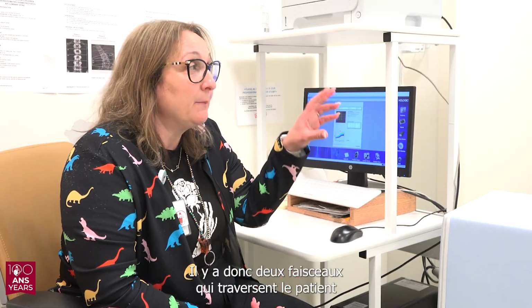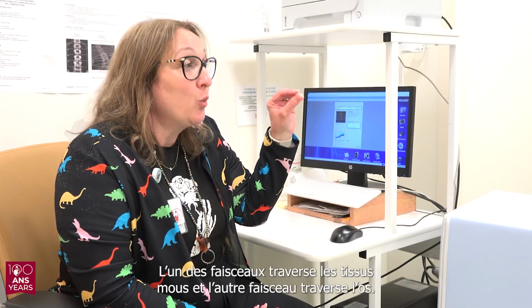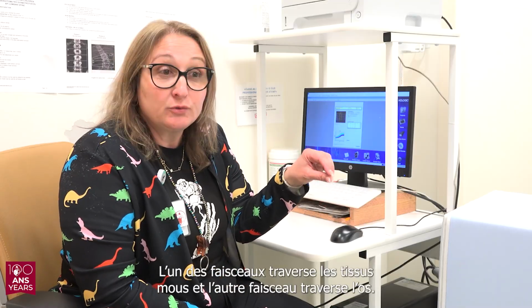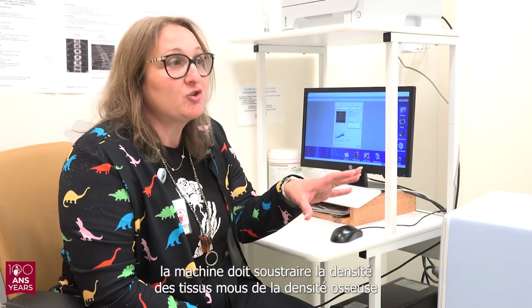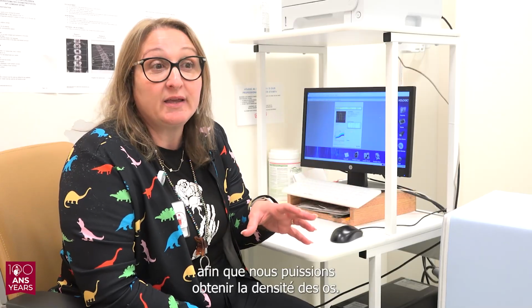It has a dual energy, so it has 2 beams that go through the patient while we do the exam. One of the beams goes through the soft tissue and the other beam goes through the bone. So for us to actually analyze the bone mineral density, the machine will subtract the soft tissue density from the bone density so that we can get the denseness of their bones.